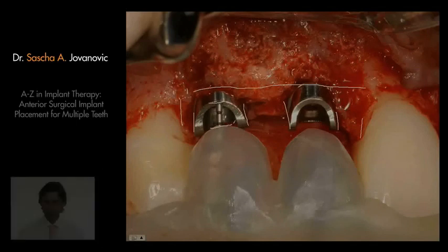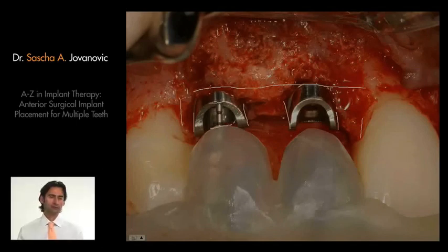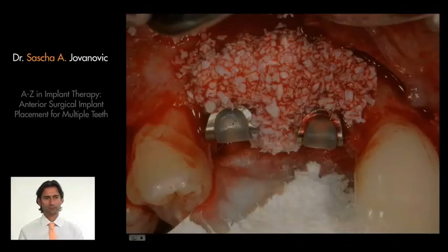So there's a treatment for these type of cases where we can allow grafting to be done with filler materials. And that's what you can see here. This is a pure filler material. It's a xenograft, bovine hydroxyapatite, particulated cancellous. And as you can see, I do two things. One is I am covering the titanium surface. I'm increasing the interproximal space between the two implants with tissue. This is artificial tissue, but it's stable. And I'm thickening the buccal bone with a couple of millimeters.